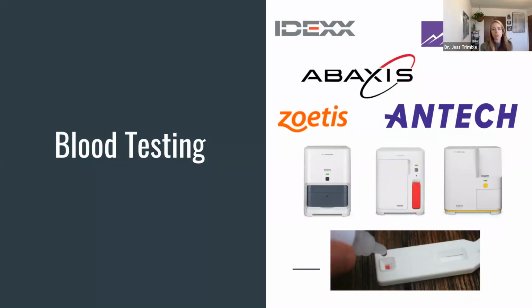A lot of these companies also make these awesome little lateral flow assays, which are a huge part of point of care diagnostics for a variety of things. Heartworm, retroviral testing, progesterone testing, there's a ton of them, and more are popping up as there is more and more research being put into finding different analytes that appear with only very certain diseases. And as we learn the specifics of diseases more and more granularly, we are able to test for these very specific things through these assays. And so we'll find more and more of these popping up in the near future.